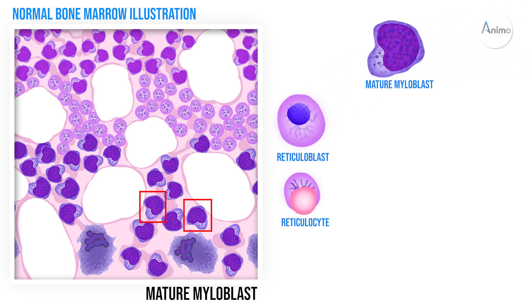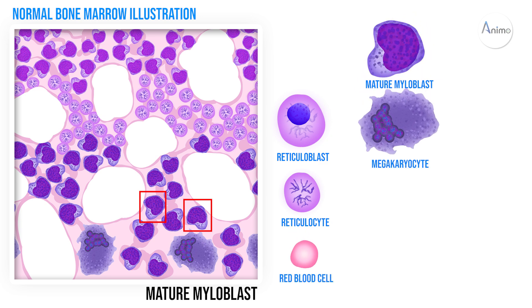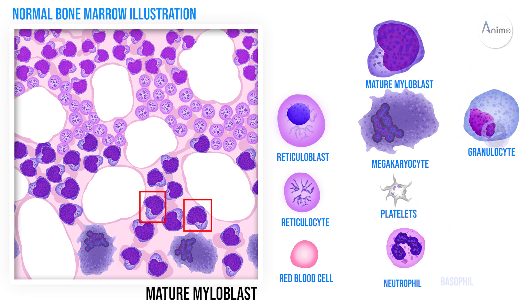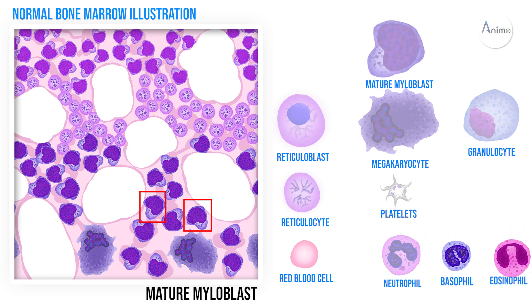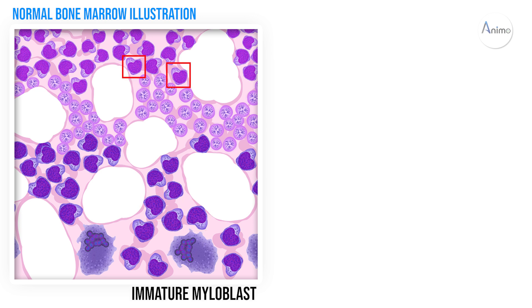The mature myeloblasts will produce reticuloblasts, then reticulocytes, and from them the RBCs will form. They also produce megakaryocytes which produce platelets, and granulocytes which produce neutrophils, basophils, and eosinophils. For a detailed discussion of these cell lineages, watch our video on blood cell lineage. Here we also see immature myeloblasts and between them reticuloblasts and reticulocytes.